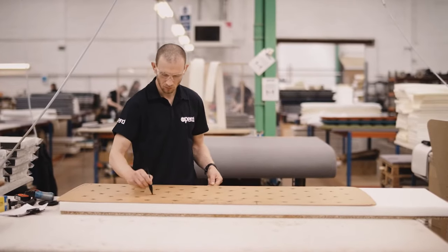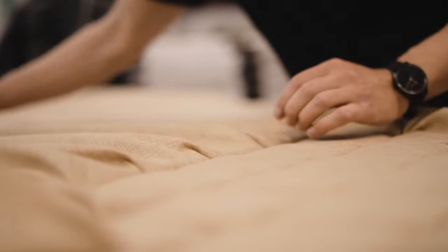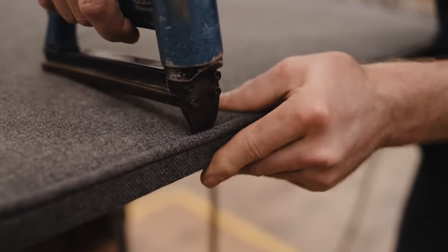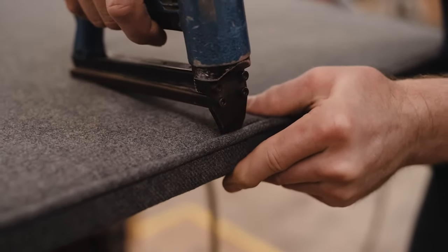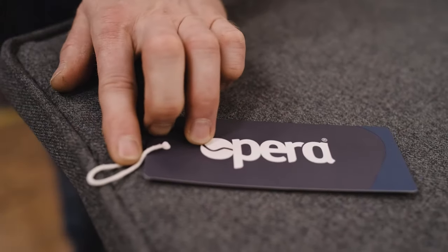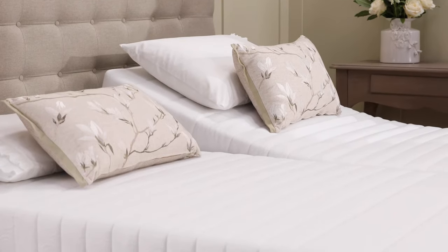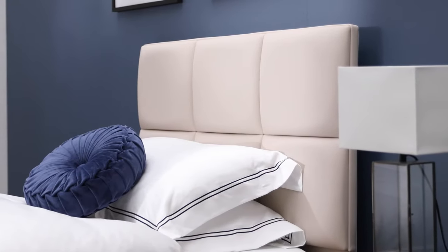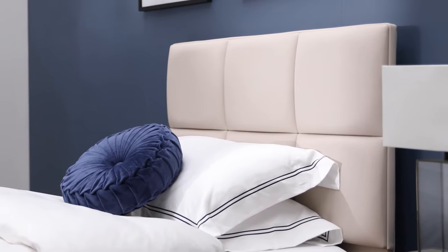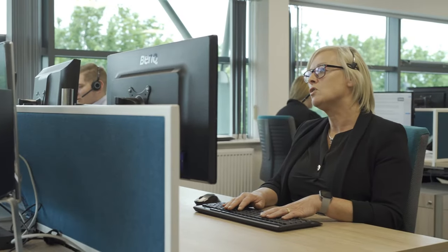Opera have long been recognized as the trusted experts in profiling care beds. All of our beds are thoughtfully designed and manufactured to the highest of standards across the UK and Europe. Longevity is guaranteed and supported by generous warranties. We are passionate about making our products attractive and homely, and offer style, headboard material, and wood finish options so you can scheme the bed with your bedroom.